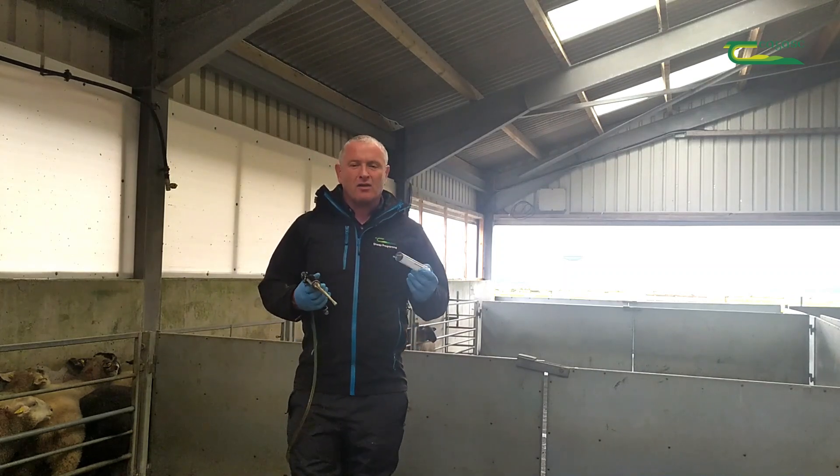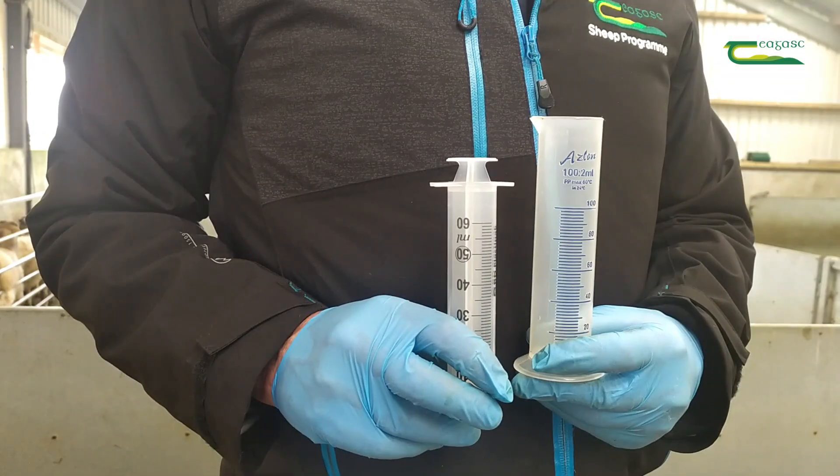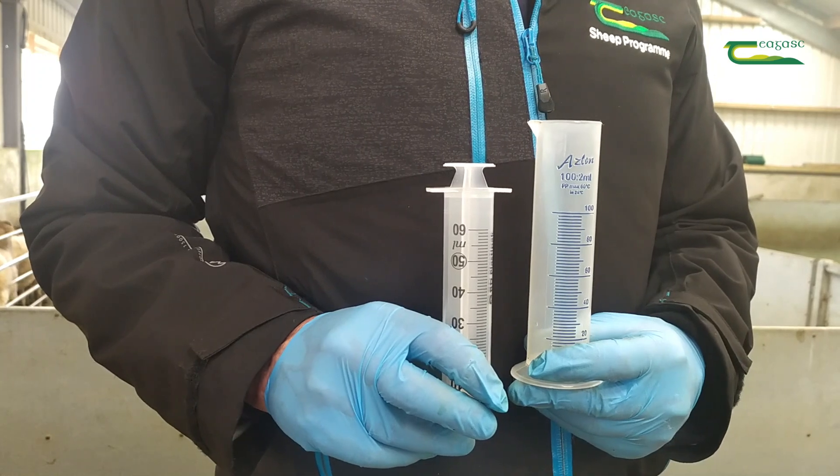So what we then need — you can use a graduated cylinder or something like that to measure. What you're more likely to find on farm is one of these 60 ml syringes.